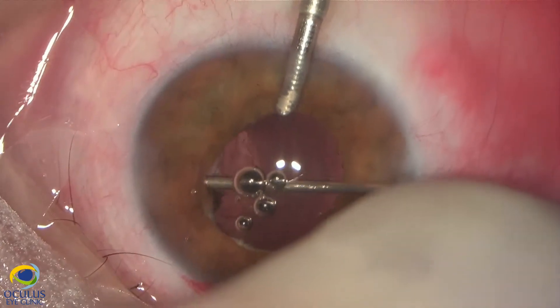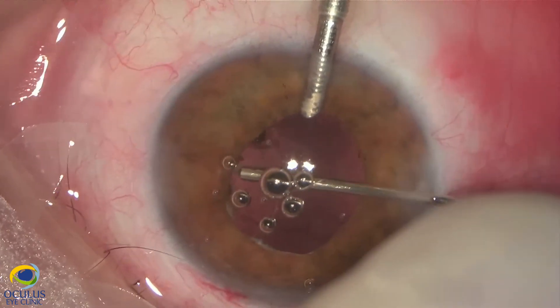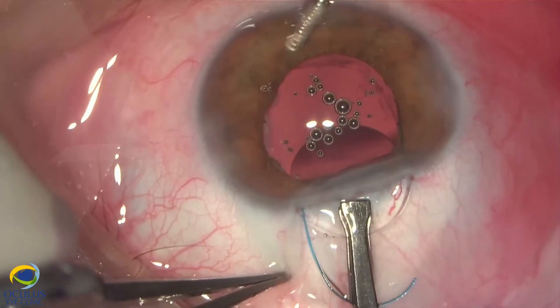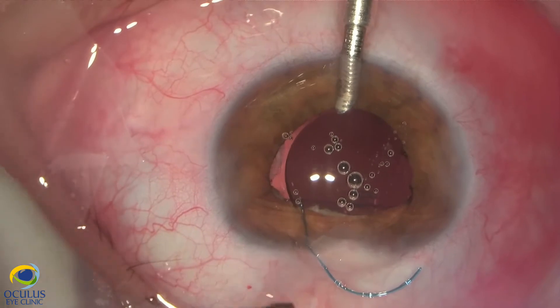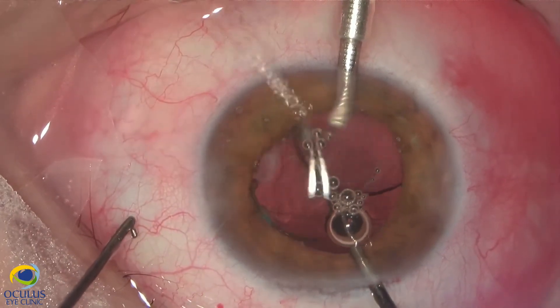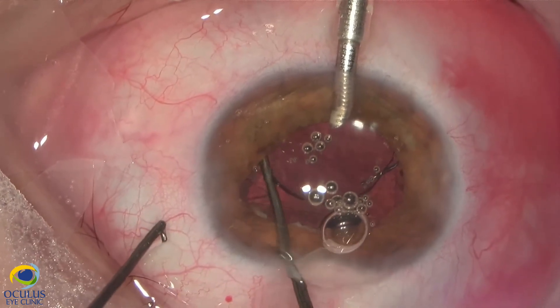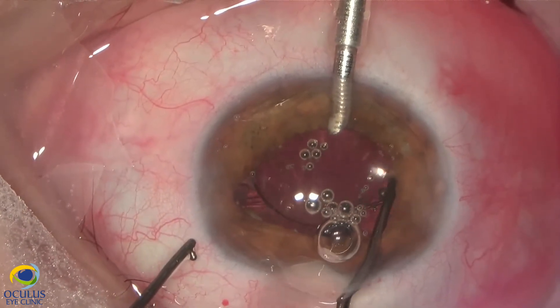Unfortunately, because it is a PMMA lens, we had to enlarge the limbal incision to 5.5 mm. We decided to implant a 3-piece IOL which is longer — 13 mm in length and 6 mm optic part. Since we already had an enlarged incision, we preferred to implant it unfolded, although it is a foldable lens, because implanting it unfolded gives much more control on the implantation.